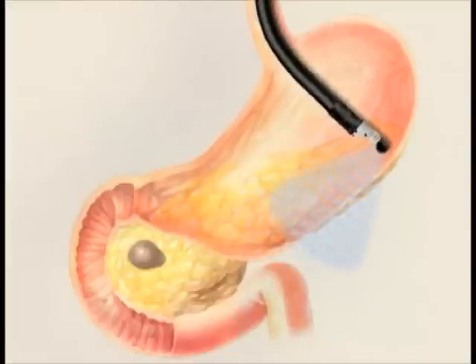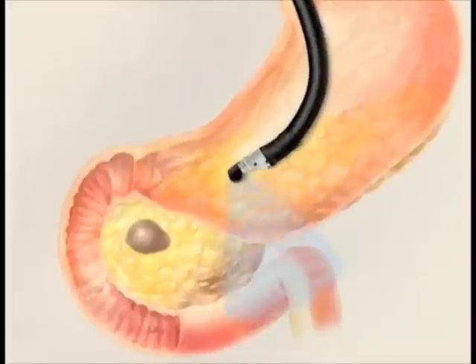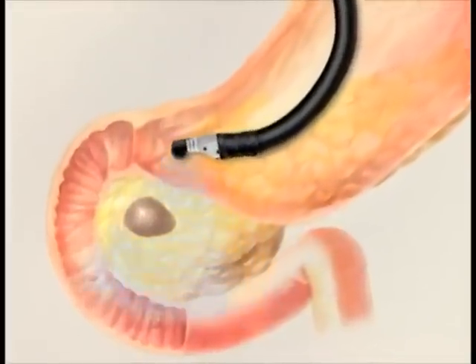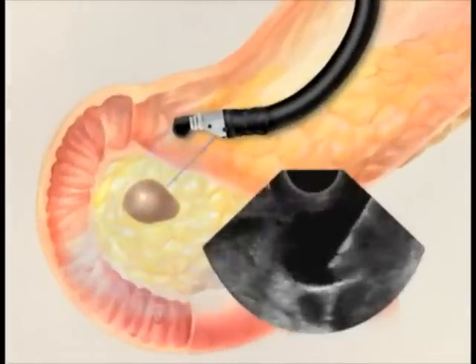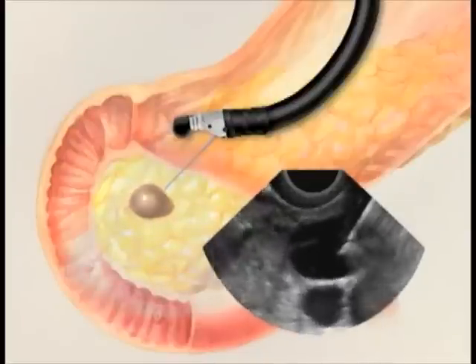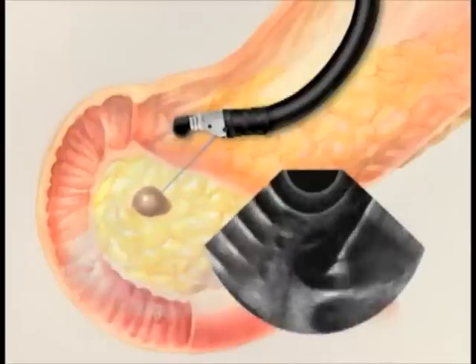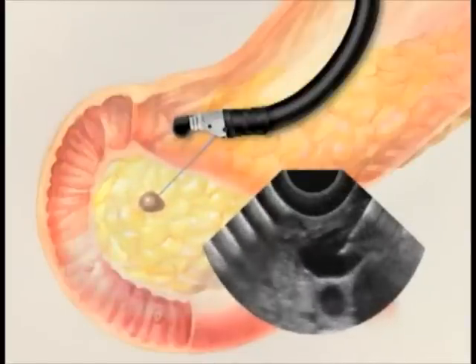After thoroughly checking the pancreas, the endoscope is positioned over the cyst that was discovered. The cyst is carefully examined to detect any abnormality. A very fine needle is passed through the wall of the stomach or duodenum and into the cyst, and suspicious areas can be sampled.